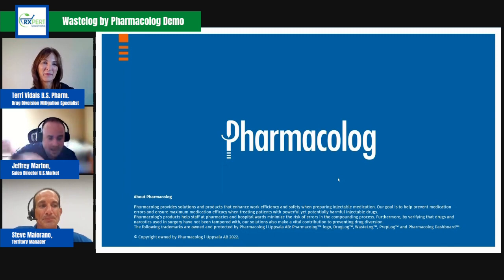So we have the ability to scan that barcode, and that information populates the preparation ID field, the date, everything, and everything gets saved, which is really nice. How does that work if a hospital is ordering something from a different manufacturer that puts it in syringe for them versus the wholesaler where it comes pre-done already? Does the pharmacy itself have to enter all of those scans in so you have a baseline, or do you keep a database, or how does that work?